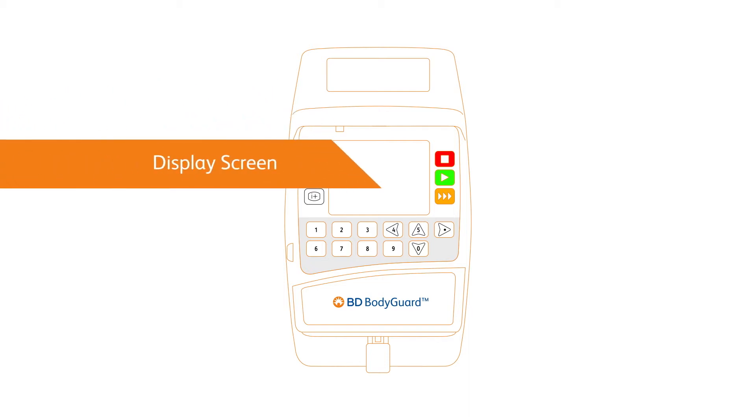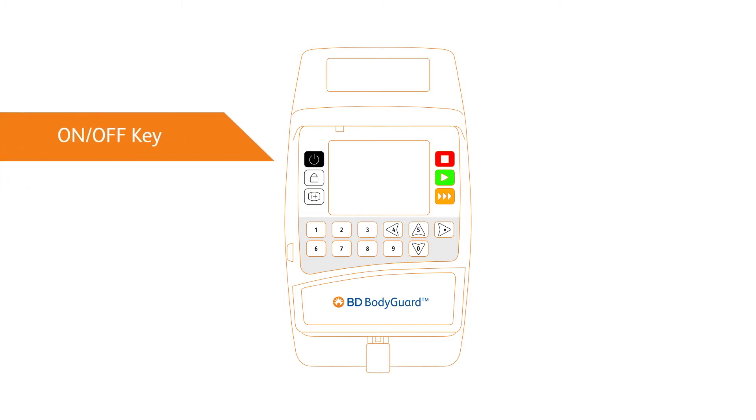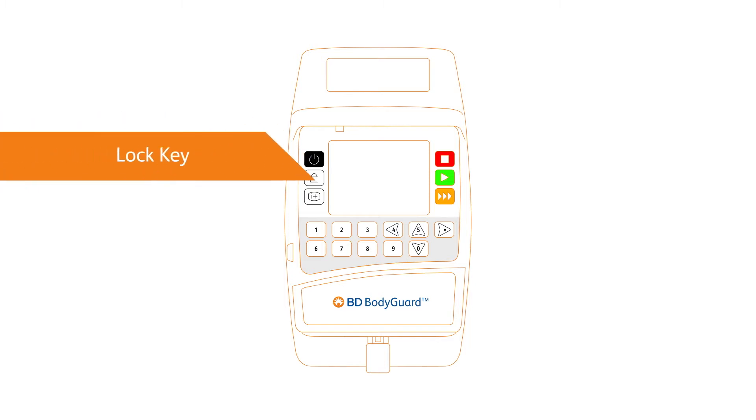Depending on treatment setting, the display screen confirms pump and infusion status, or programming choices and setup instructions. The power key turns the pump off and on. The lock key reduces programming error and tampering by locking and unlocking the pump navigation.